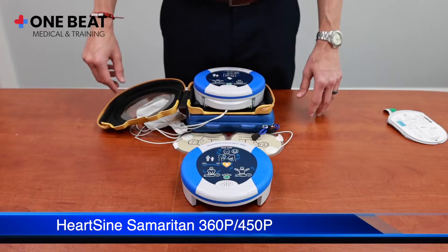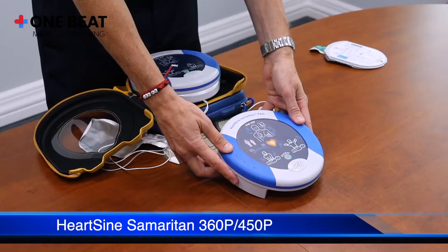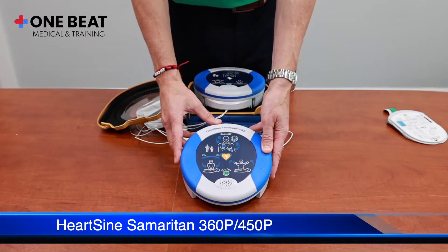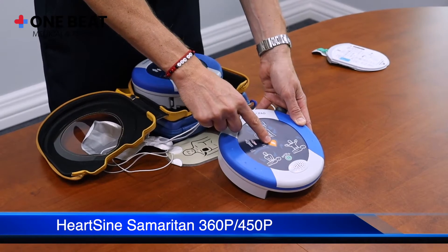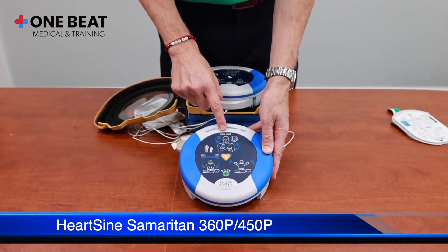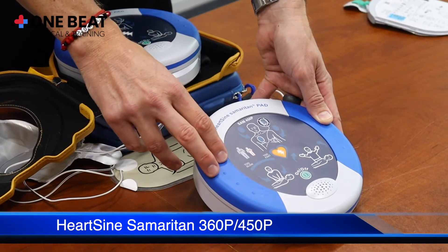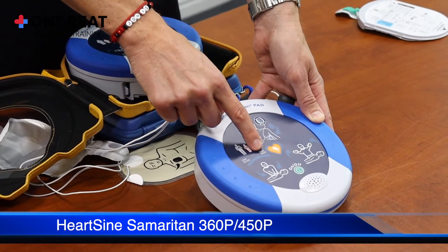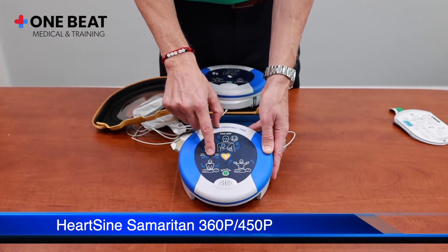Similar to the HeartSine Samaritan 350p, we have the HeartSine Samaritan 450p. They are both semi-automatic AEDs that require the shock button to be pressed when a shock is advised. The additional feature of the 450p is a CPR rate advisor, which will advise the rescuer if compressions are too slow, too fast, or just right — the light would illuminate in the middle.